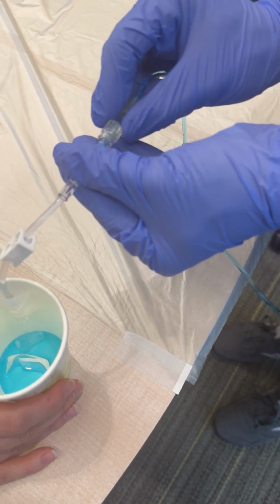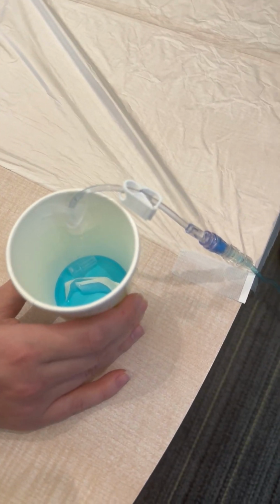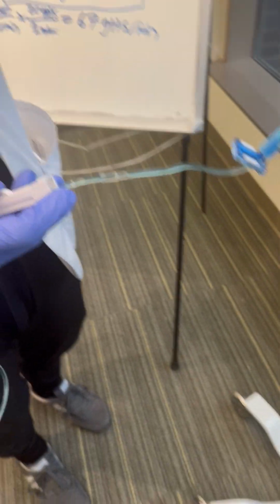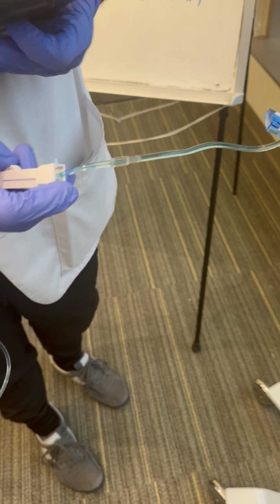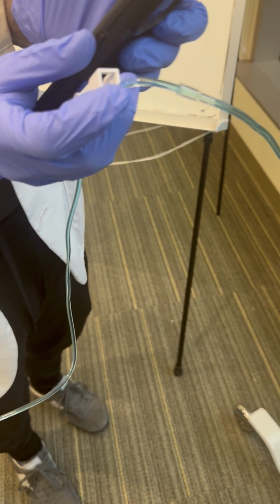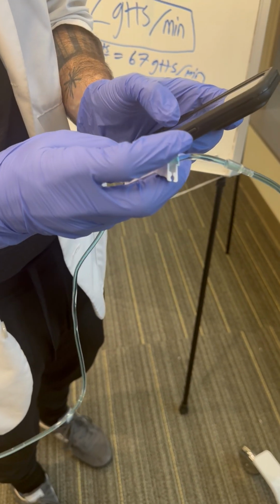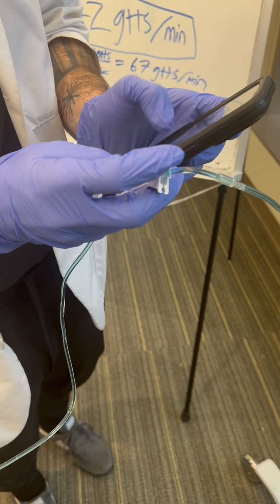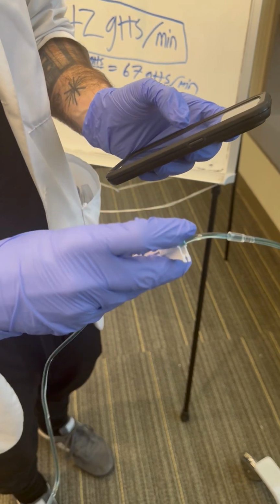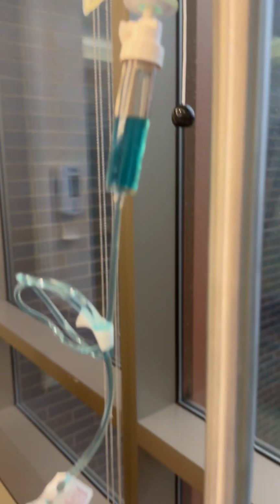Okay. Go ahead and hook this up here. Open up the line. And so for the sake of this video, I don't have a clock here, but I'll open up my clock app really quick. Definitely wouldn't do this in the room. Usually the rooms have clocks. So, okay. I'm gonna slowly start opening this up here, and I'll count the drips.